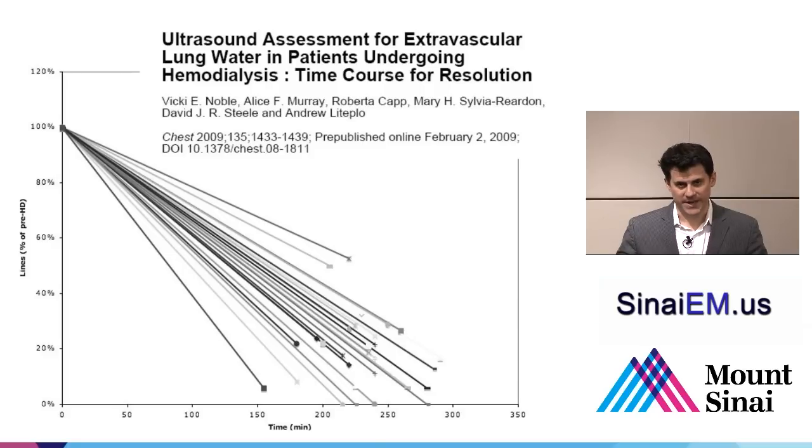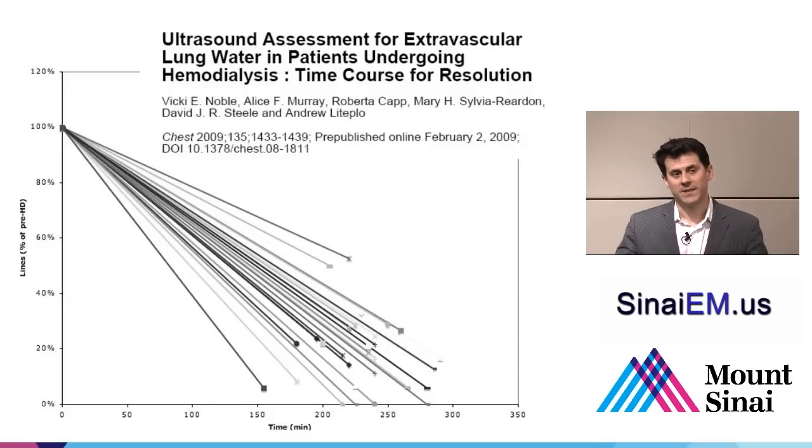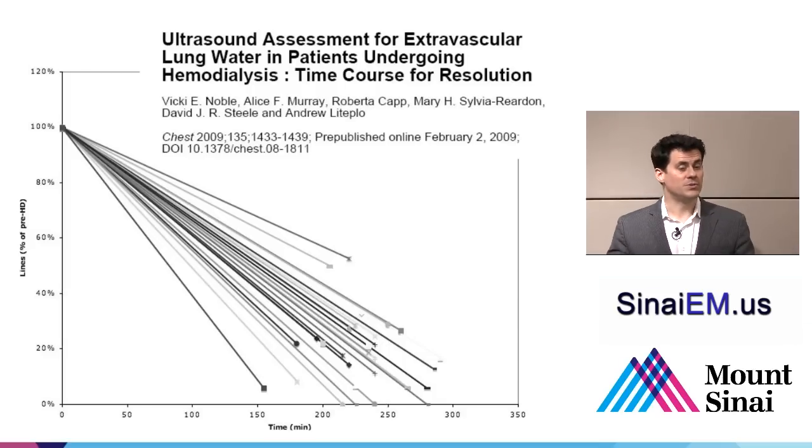That would be much faster than we would see a B-type natriuretic peptide level change, much faster than we would expect a chest x-ray to demonstrate changes. So what this also demonstrates is the potential that thoracic ultrasound and B-lines in particular could be used not only to assess for CHF, but to assess for resolution of CHF. It could potentially be used to monitor therapy. It could be used as a goal of diuresis or a goal towards inotropy or whatever other therapies are being used for your patient in their acute decompensated heart failure.